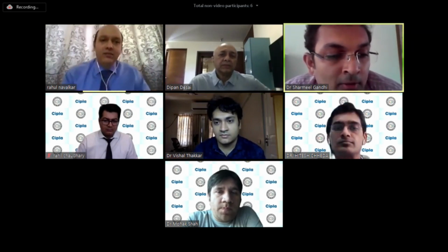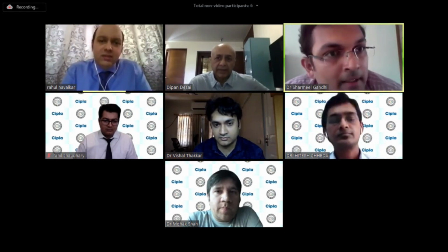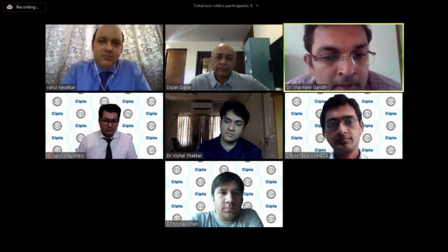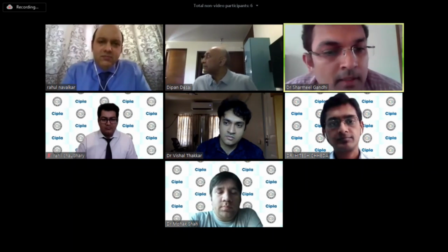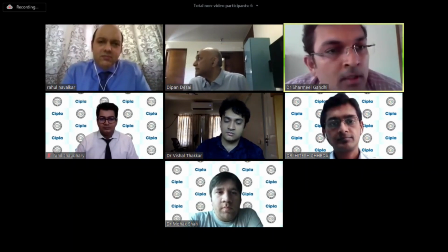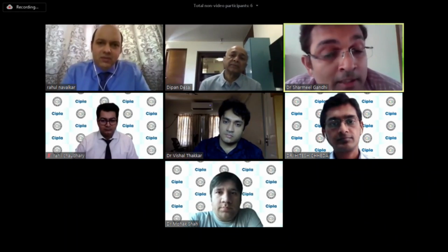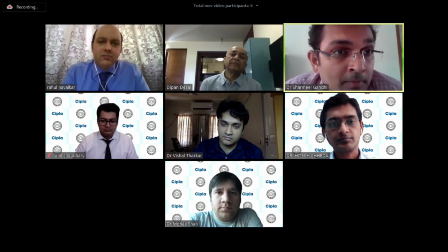Correct. But I would like to say that I operated on this case a year back, and I consulted many of the lens companies about what I should do, because these were two different things coming up, and we opted to put a non-toric lens. The patient was ready, in fact, to go for a toric lens, but we opted not to. And we actually got -1 cylinder, and that patient was freaked out.